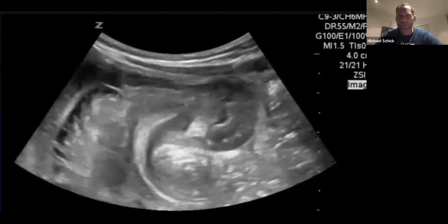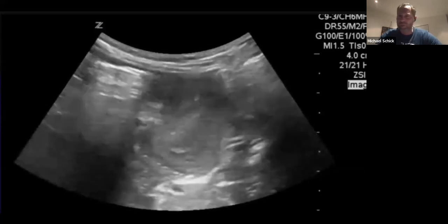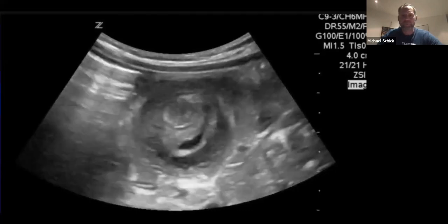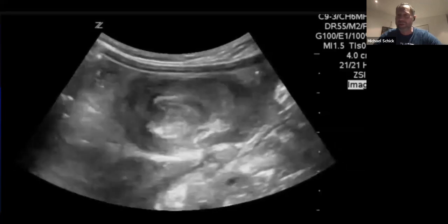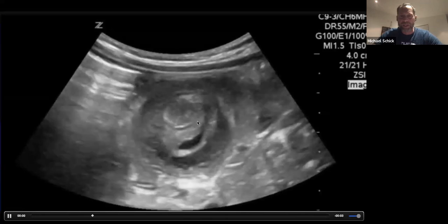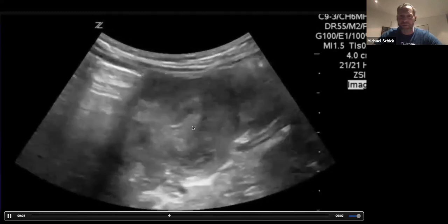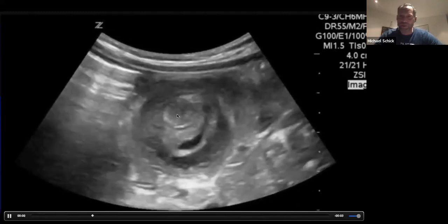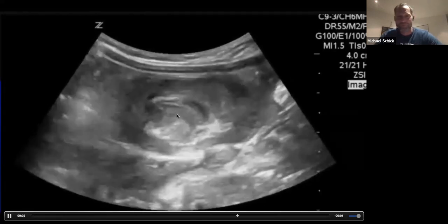You do an ultrasound, and this is the right upper quadrant of the patient, just kind of below where the liver is. I know just based on the description and the age of the child, you know the diagnosis, and what you're seeing here is a lumen of bowel kind of stuck within another lumen of bowel, giving you that sort of sandwich sign or pseudo kidney sign. There's a lot of names for it. And this is, of course, intussusception.